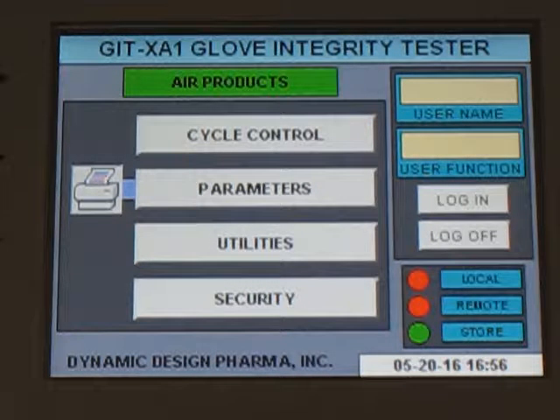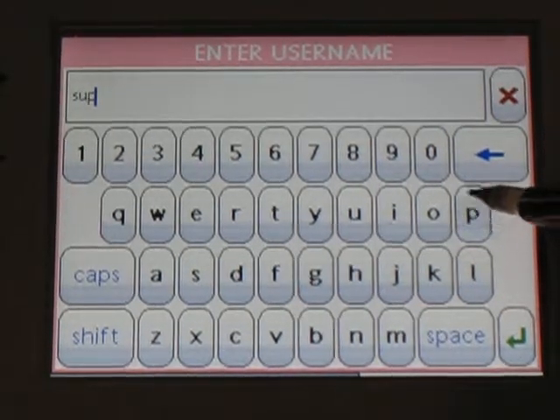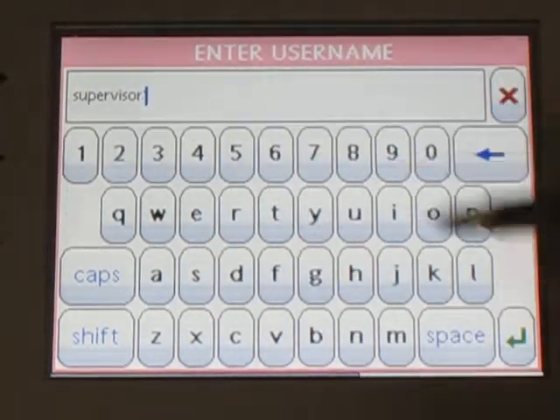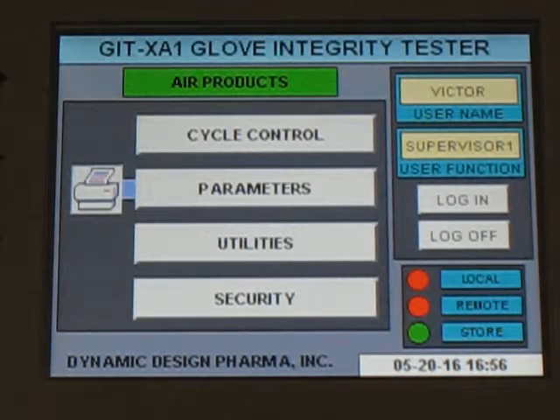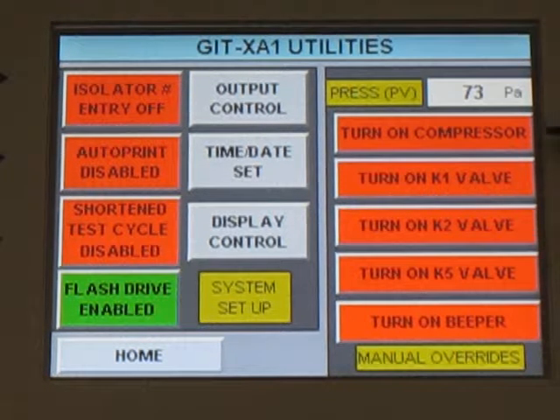This video covers the diagnostic functions that are included in the utilities section of the program. In order to access the utility section, I have to log in as a supervisor, so I'm going to do that. The password is PW, which is our default password. So now I can go into the utility section, and these are the functions that I'm going to be covering.